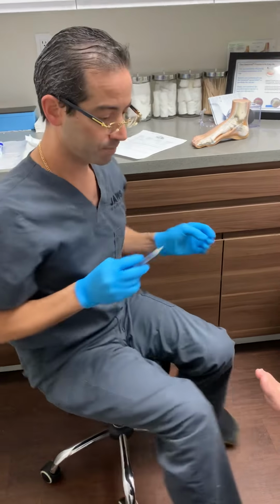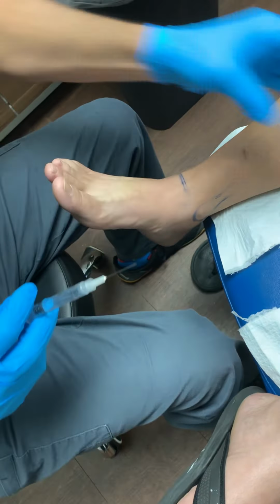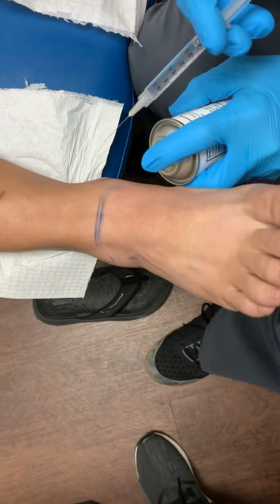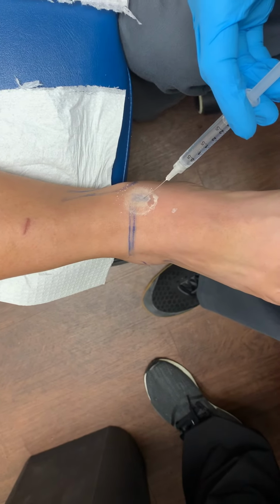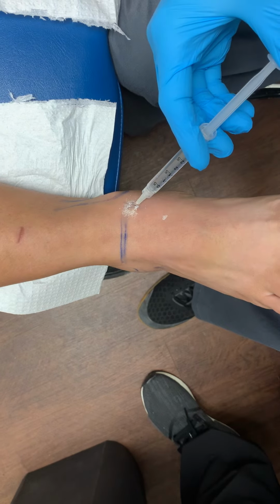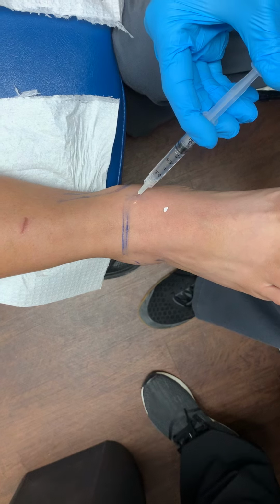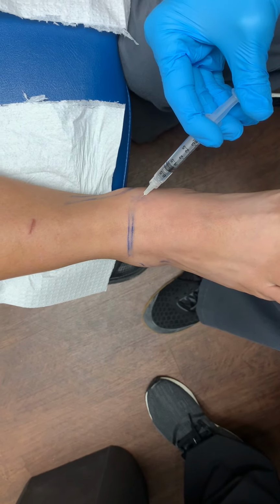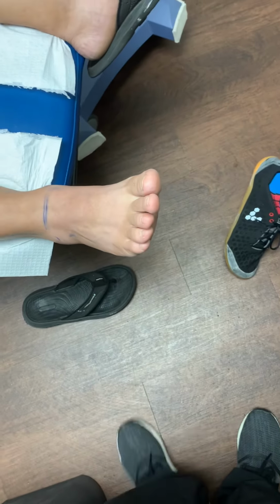Okay. So again, just like that, cold spray. I always tell the patient they'll feel a little stick. Okay, let's get a good shot there for all of our viewers. And right there, pinch all the way in. And now we infiltrate. Patient will maybe feel a little bit of burning, maybe a little bit of pressure. That's number one.